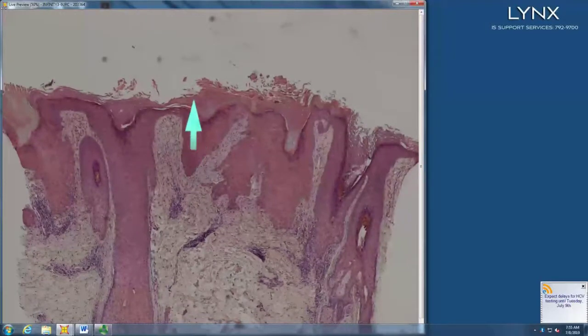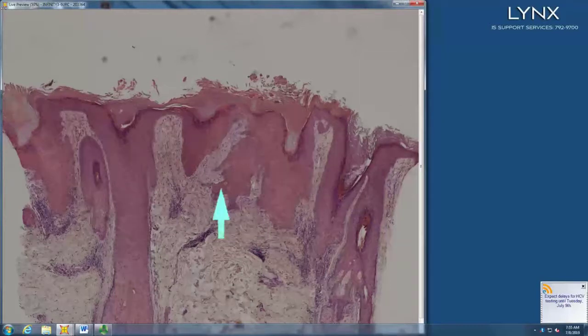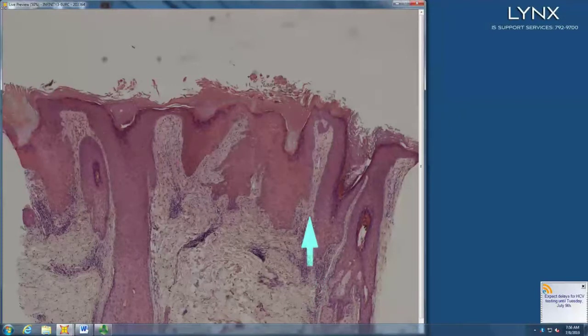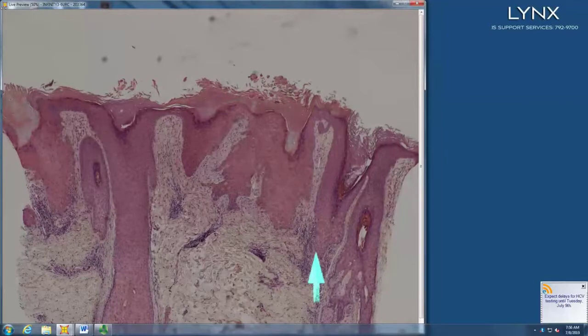Hyperkeratosis, acanthosis, elastic trapping, and then what's happening there? Lymphocyte infiltration. And is it leaving the epidermis alone or damaging the epidermis? Damaging. So you've got an interface dermatitis. So you have hyperkeratosis, follicular plugging, PEH, and interface dermatitis damaging the basal layer.